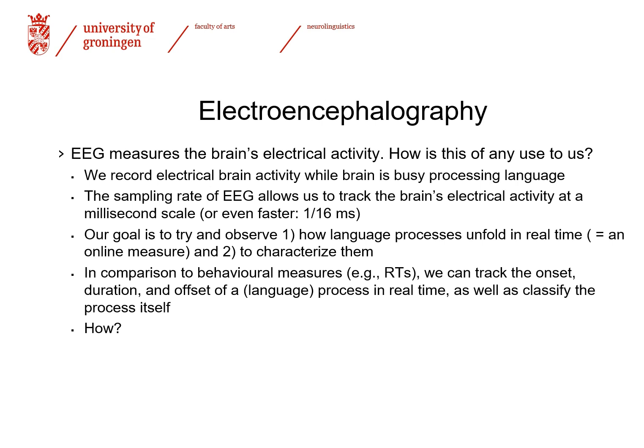And by something, I mean language content. It can also potentially be while that person is producing language, that is speaking, but that's something we'll talk a tiny bit about later. So in this setup, we have a participant who has an EEG cap mounted on their head with a number of electrodes. They are exposed to some language input, visually or orally, meaning through the ears, and the electrodes are picking up on their electrical brain activity and the changes therein at an extremely fast pace.